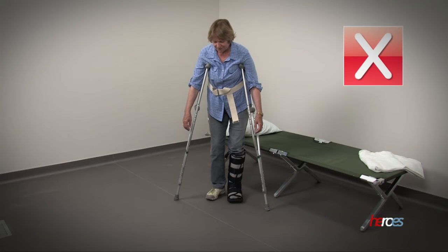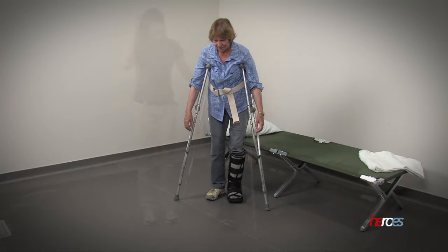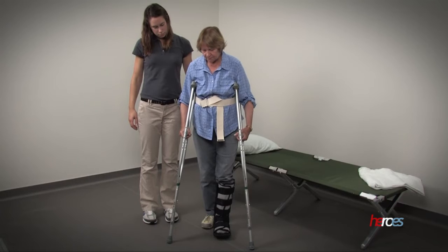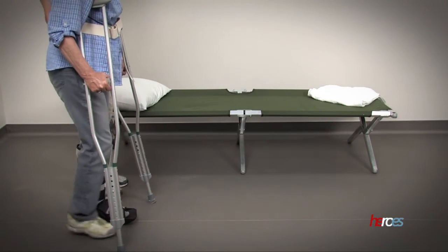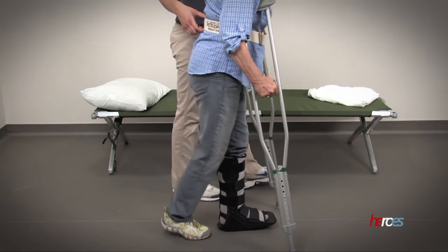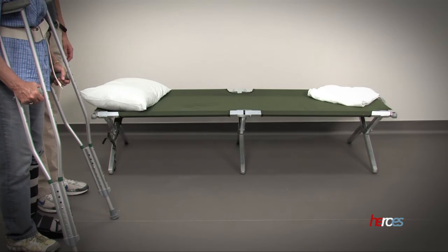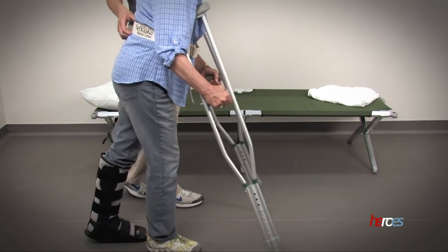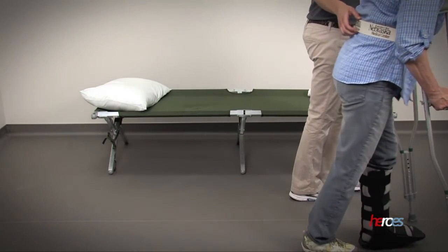When using crutches, instruct the individual to avoid resting on the armpits, as this may irritate the skin and nerves. The individual should place only as much weight through the affected leg as they are able to tolerate. It is safest to begin by using a step-two pattern in close quarters, meaning the lower extremities are advanced only to the point of the crutches. However, if the individual feels comfortable and there is adequate space, they may choose to use the step-through pattern, meaning the lower extremities are advanced past the point of the crutches.